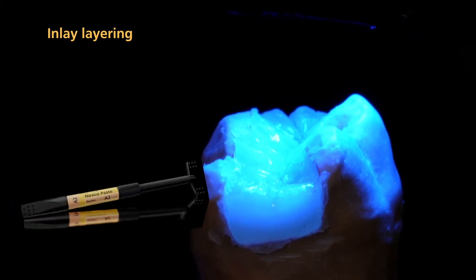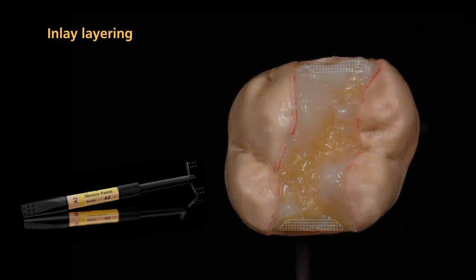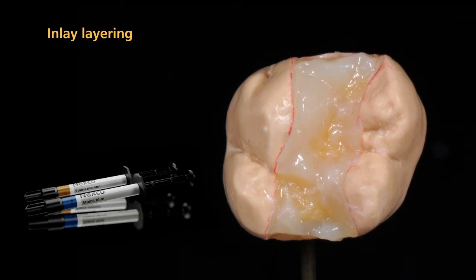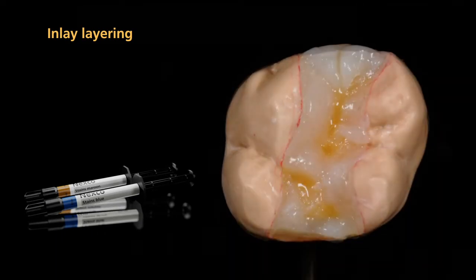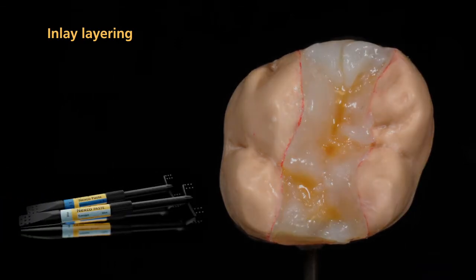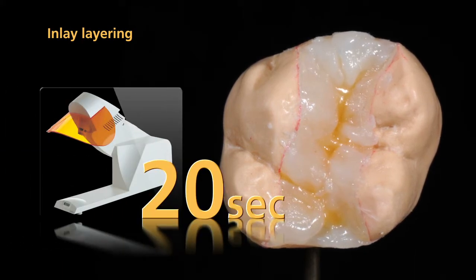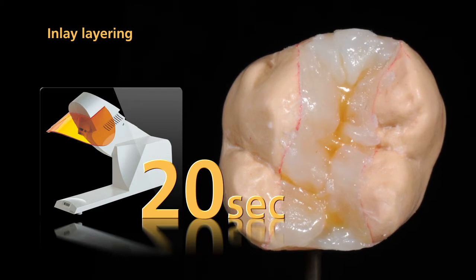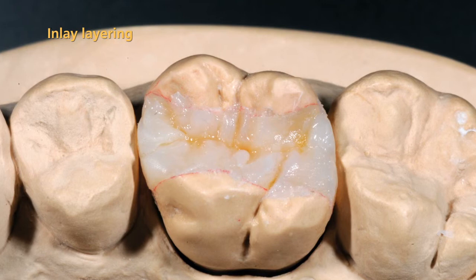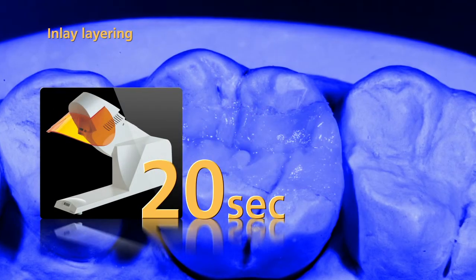Slightly emphasize the marginal ridges with dentin. Subsequently, build up the dentinal plateau with dentin materials. To intensify the shade effect, apply characterizations with SR Nexco stains and cover them with incisal and effect transpa layering materials. Pre-cure the areas built up with Nexco by illuminating each segment again for 20 seconds. Subsequently, establish a lifelike occlusal morphology and pre-cure all areas for 20 seconds using the quick pre-curing light.